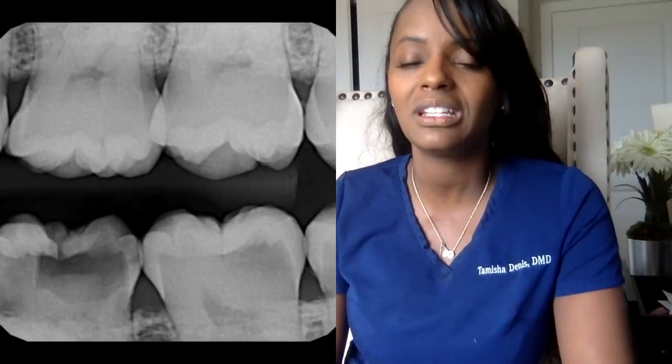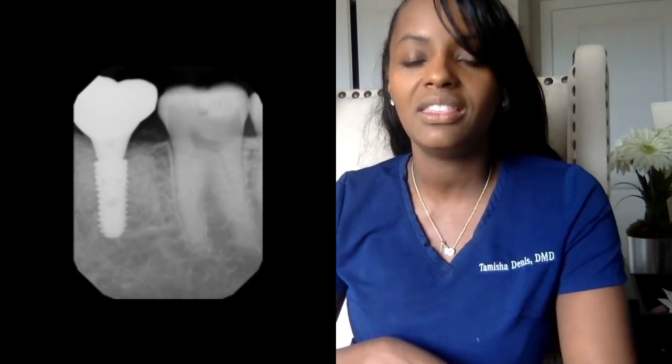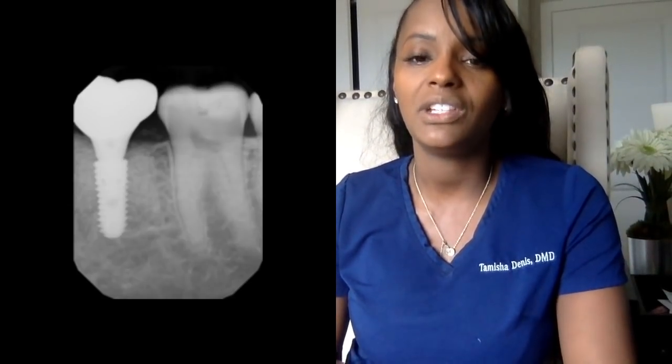Before we talk about what happened to him in particular, we're going to go back in time to about a year ago. He had a really large cavity on tooth number 19, and tooth number 19 had a really big cavity. Originally we thought we were going to do a root canal, but unfortunately as the procedure went, the tooth broke apart in a lot of pieces because the decay was too far gone. So we decided to pull the tooth and in its place placed an implant. Because he learned his lesson, we also did a lot of other fillings. The tooth right behind it, which is tooth number 18 — which is what we're going to be doing a crown on in this video — also had a large cavity. I went ahead and filled it, went the conservative route. He wasn't having any pain on it, and it was quite large, but at the time a filling just made the most sense.